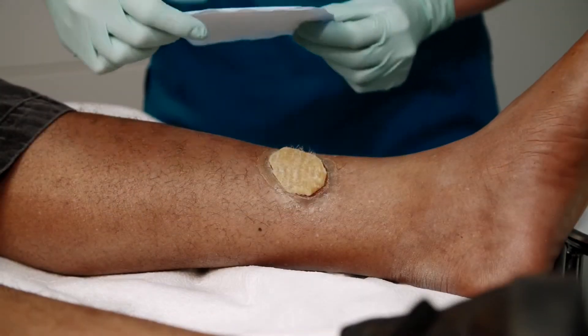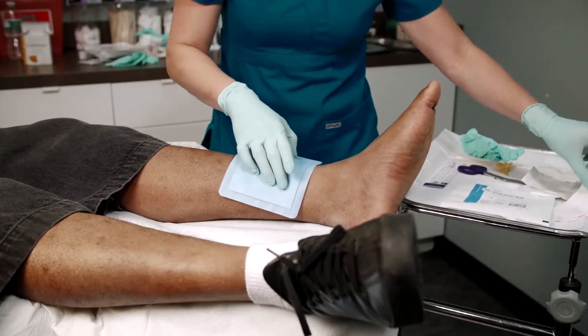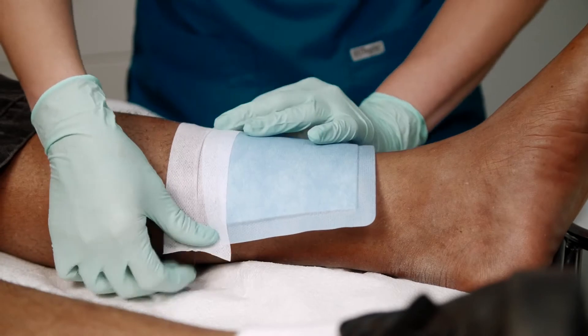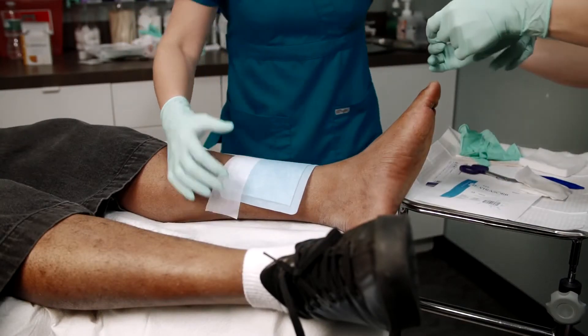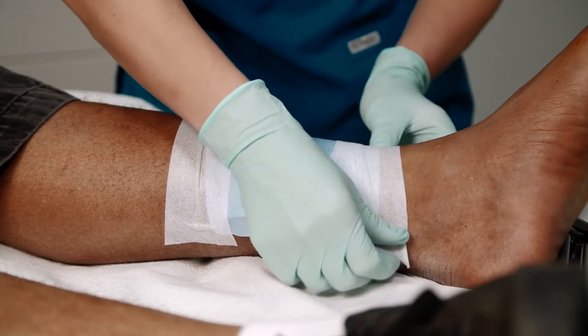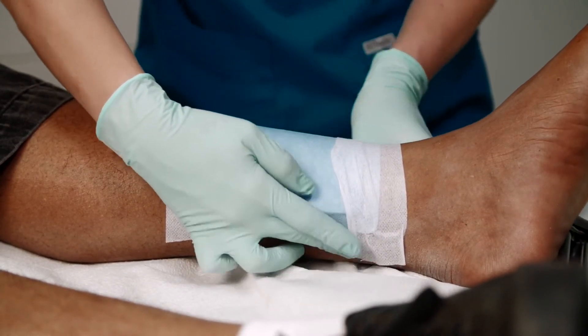Because the MetaHoney Calcium Alginate will ultimately form a gel and also helps to move additional fluid to the wound bed, you must use an absorptive secondary cover dressing. Here, we are applying the superabsorbent Extrasorb Classic dressing to protect the wound and handle exudate. We affix the Extrasorb Classic with tape, making sure it's firmly in place.